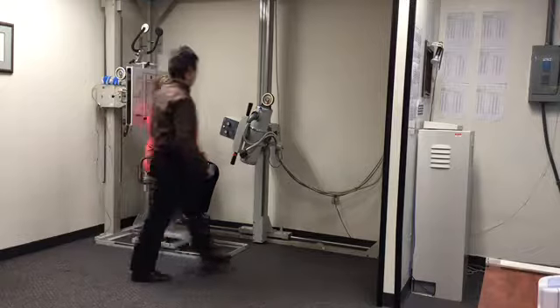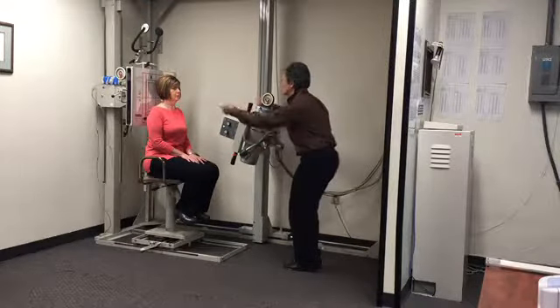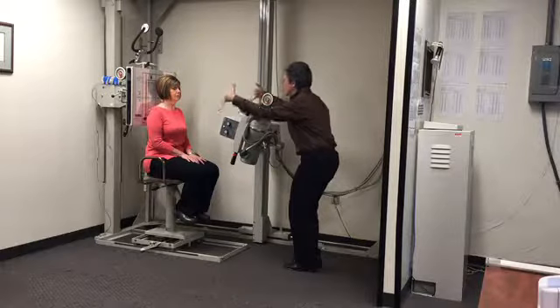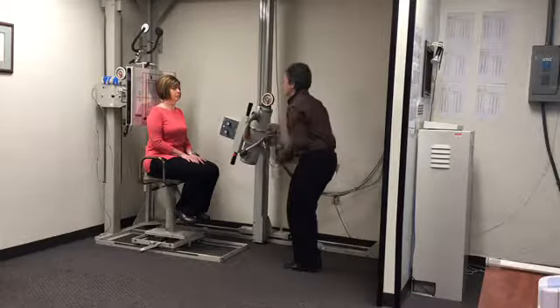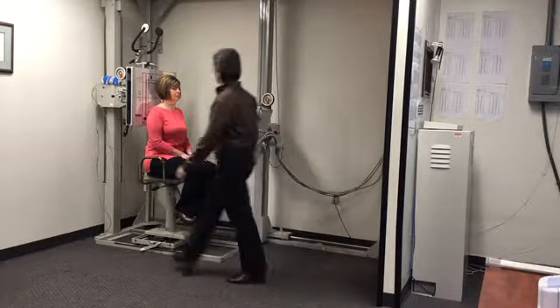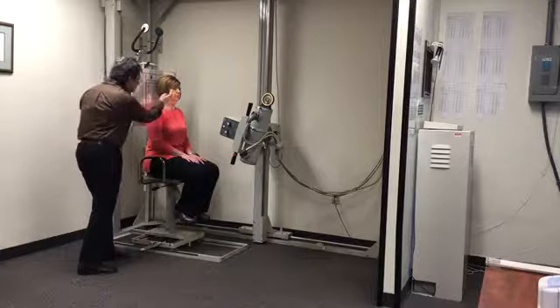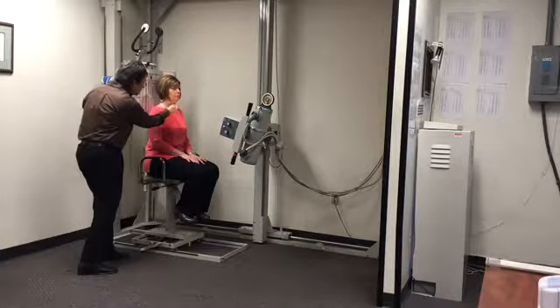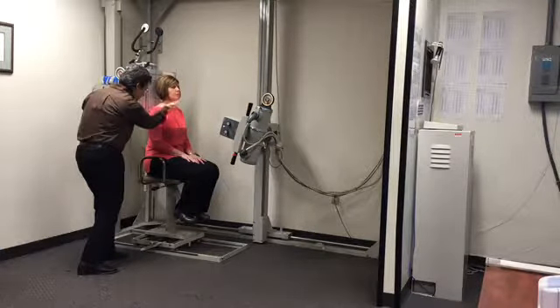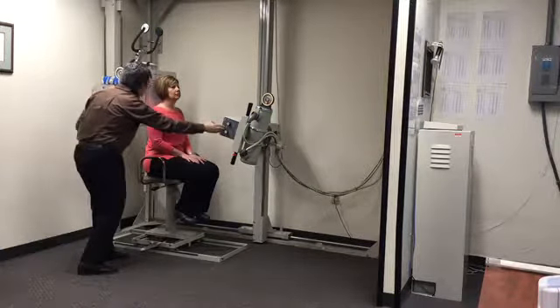I'm also going to check for any head rotation and tilt I see in the setup. If I see any, I would take out rotation by turning the chair. I would take out tilt by leaning her at the waist, but her posture looks good. So we're going to leave her in this position. We don't head clamp the patient for any specialty images. However, I need to, for this image, have her raise her chin until the body of the mandible is parallel with the floor. Okay? It's important that you keep her chin elevated for this image.